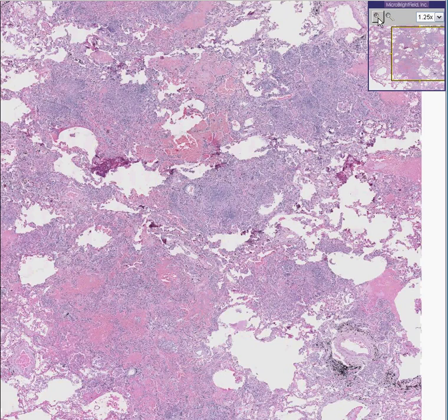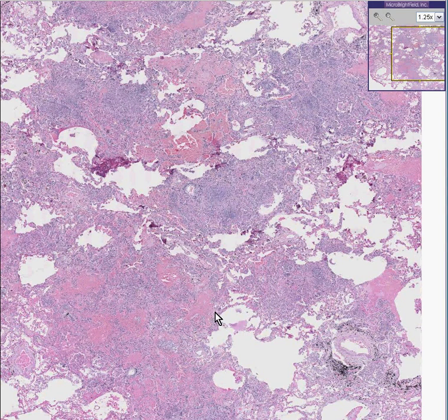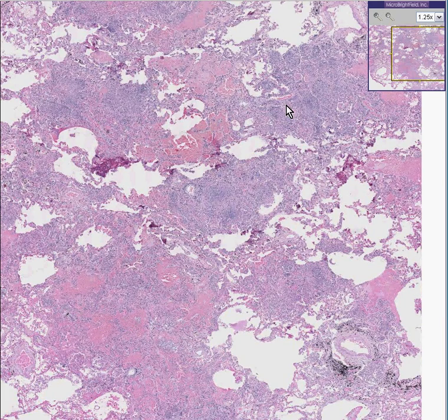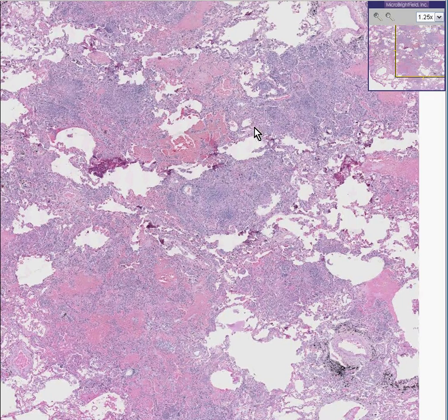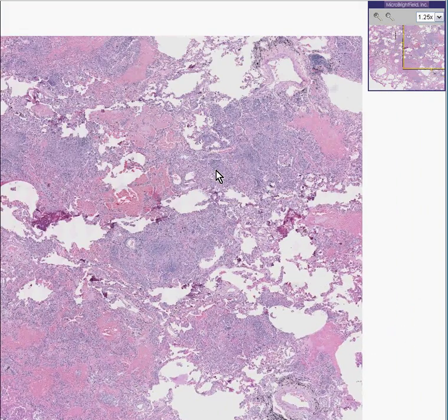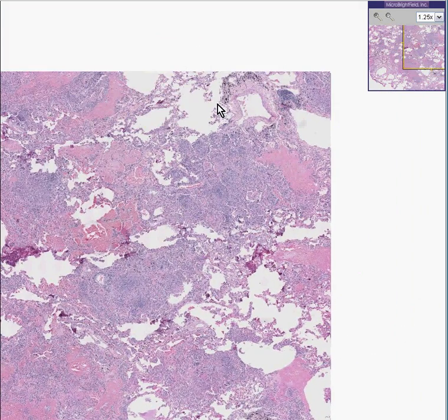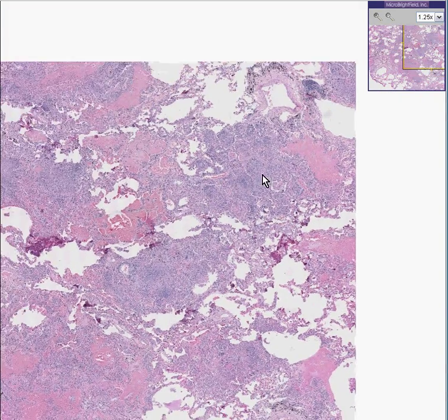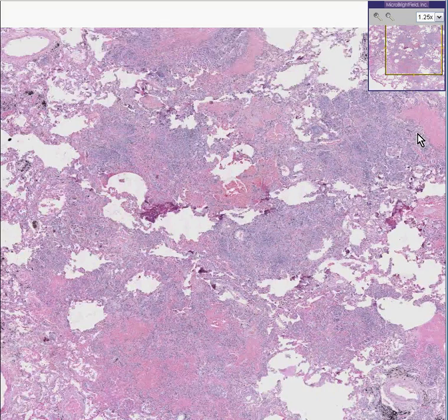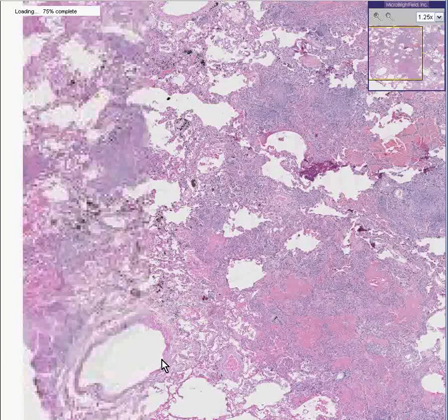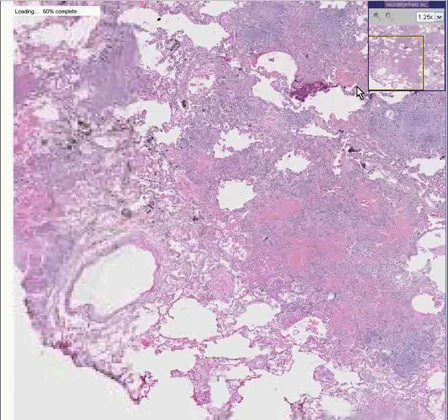Instantly we can see we're dealing with lung, even though most of the lung is replaced by inflammatory cells, necrotic debris, and fibrin. There are still some areas where we can see outlines of alveoli, and we can also see that some of the alveoli are a little over-distended, or what we would call emphysematous.